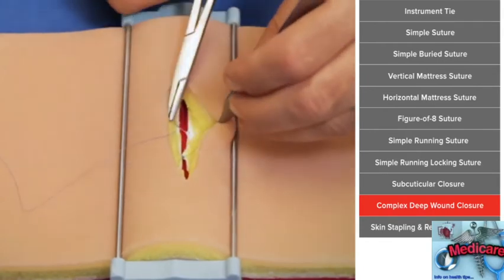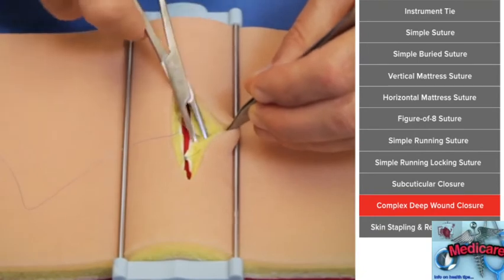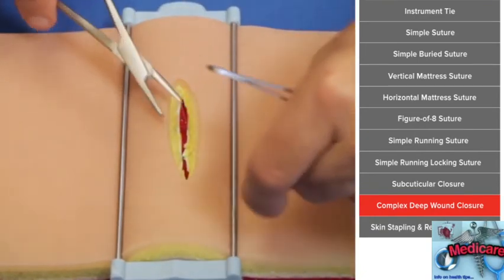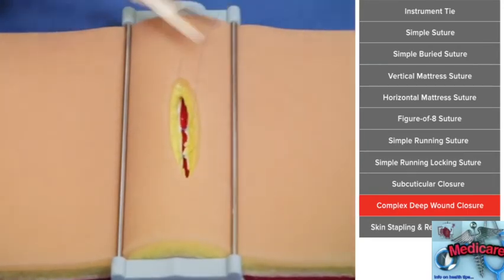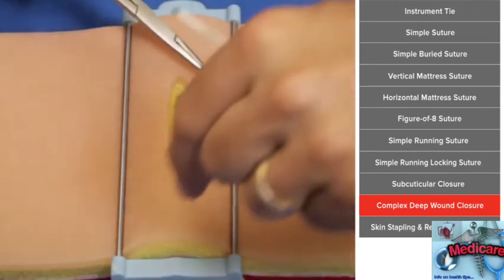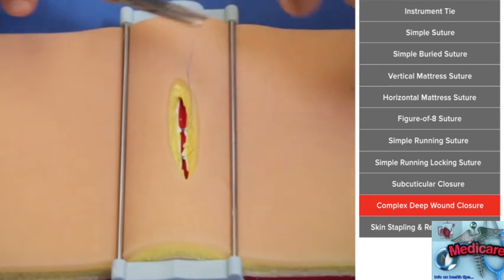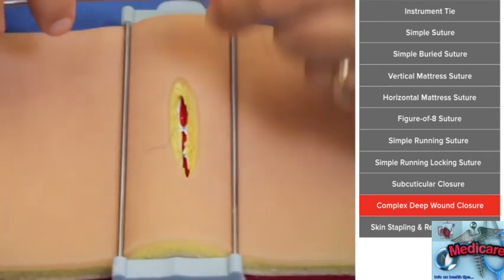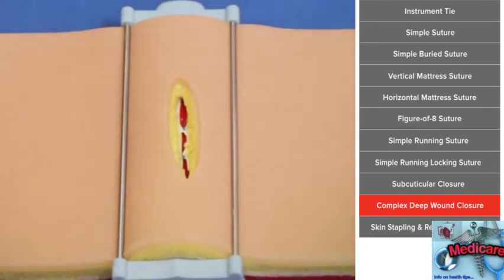And again, you sort of put a stitch in, see what it does, put a stitch in, see what it does. That's the way that we do it in surgery. Sometimes you need a lot of stitches, sometimes you don't. Stitches are foreign body, so potentially if you're worried about infection and things like that, you'd use an absorbable suture, so it's not going to hang around, or at least less permanent suture. If you're not locking, remember you can always throw an extra throw, like 3 throws, or you can just do what I just did, which is sort of lock it down by pulling on it.